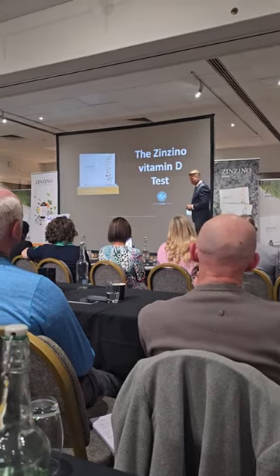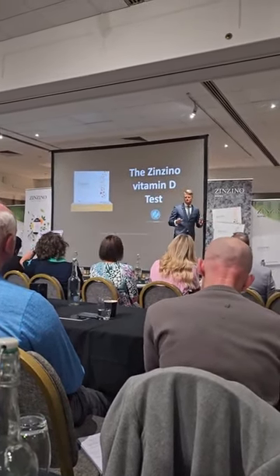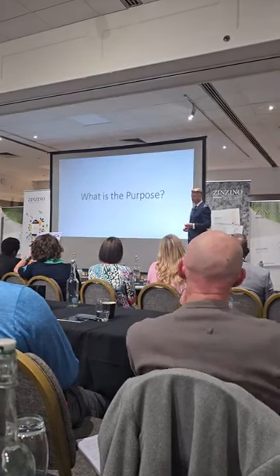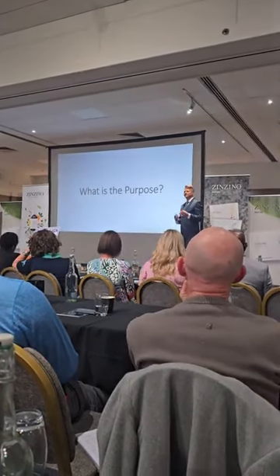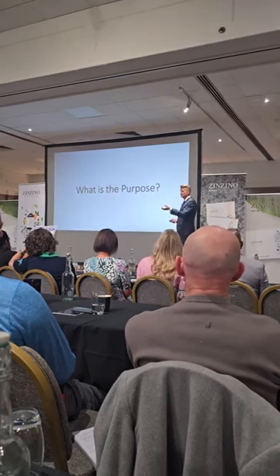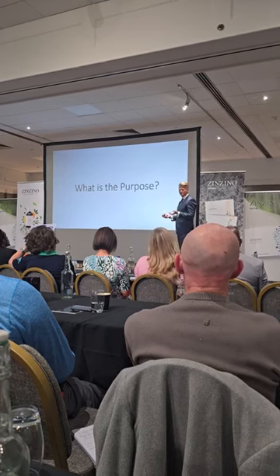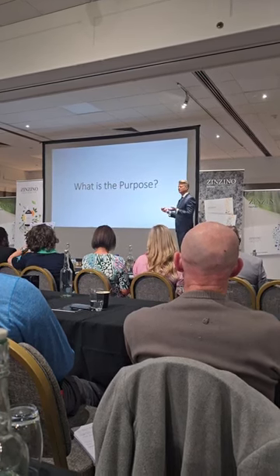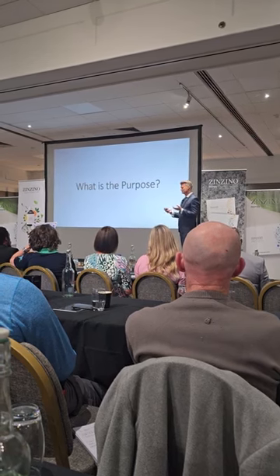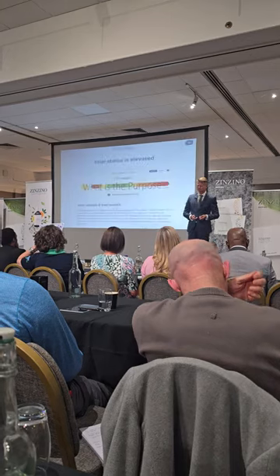So, the next topic is the vitamin D test. And this is a test you can do at the doctors as well, and the results should be totally comparable. When we validate a test, we actually need to know what the purpose of the test or the service is, to make sure it's fit for purpose, right? So we need to design tests that will reveal if the test is good enough for the purpose. So what is the purpose of the vitamin D test?